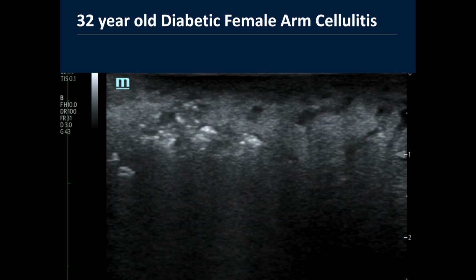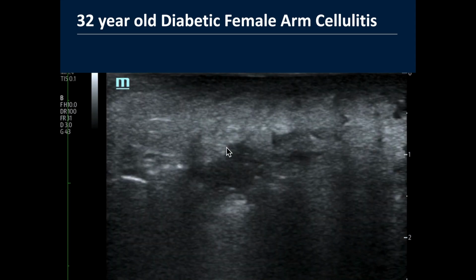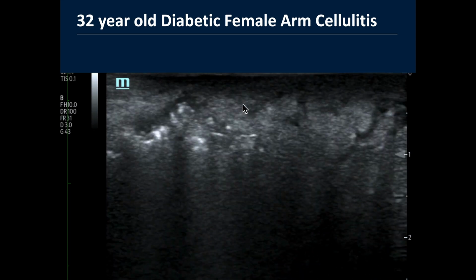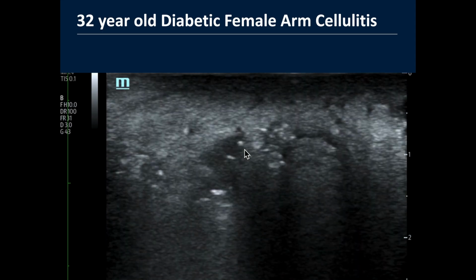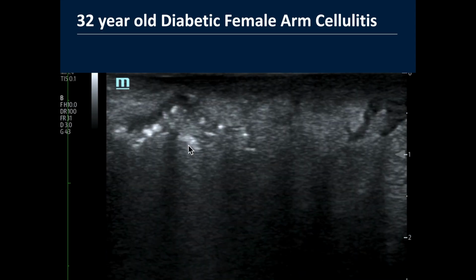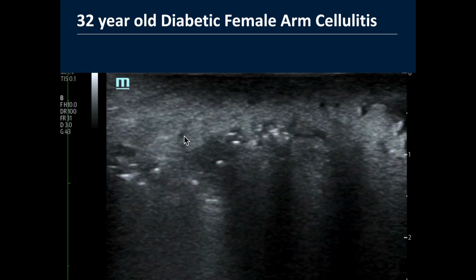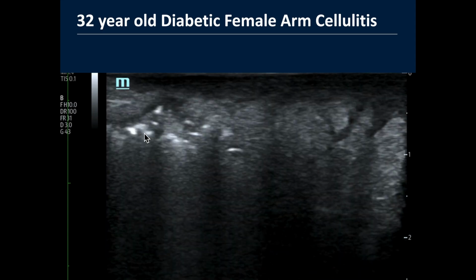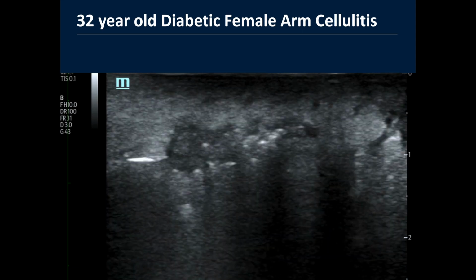And this is worse than an abscess. What is this? This is necrotizing fasciitis. Well, how do we make that diagnosis on ultrasound? Well, in this patient's unbroken skin, you should not see any evidence of air. And all of this down here is gas. So we know that it's a polymicrobial infection with gas-producing organisms, and all these white dots right here are gas. And so, yeah, absolutely.